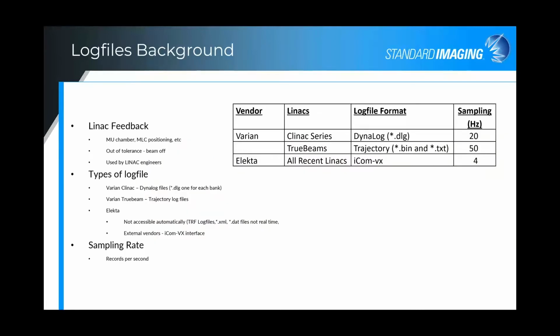So log files, let's step back and talk about some log file background. Log files were initially generated, as log files are, for any software to record what's happening. And here, of course, we record the delivery based on the feedback mechanisms designed into the Linac. Items such as the monitor unit, MLC positions, etc. Initially, they were primarily and only used by the Linac engineers. But there's really a wealth of information in those log files, so why not use it?